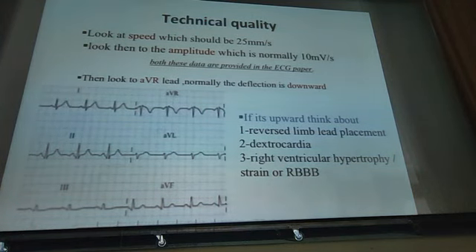Technical quality. First of all, look at the speed of the ECG paper and look at the voltage of the ECG machine.